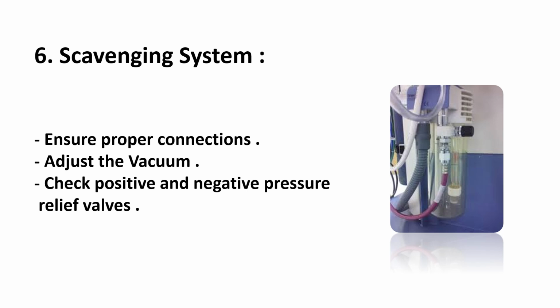And for positive pressure, we flush oxygen to the circuit. If the circuit maintains zero pressure, the positive pressure relief valve is working. If the pressure inside the circuit becomes high or increased, the positive relief valve is not working.